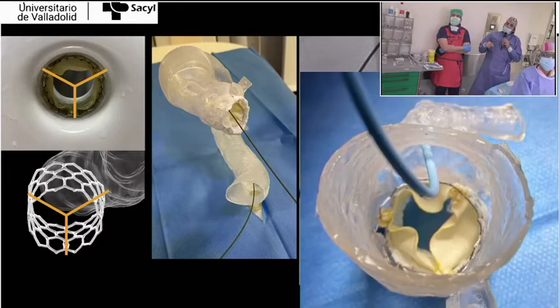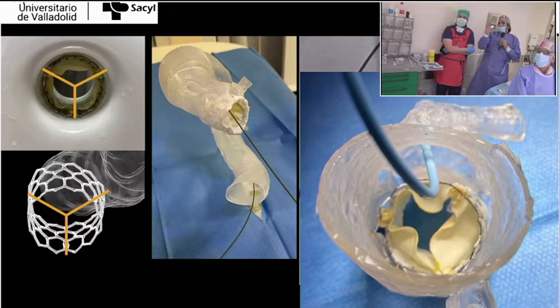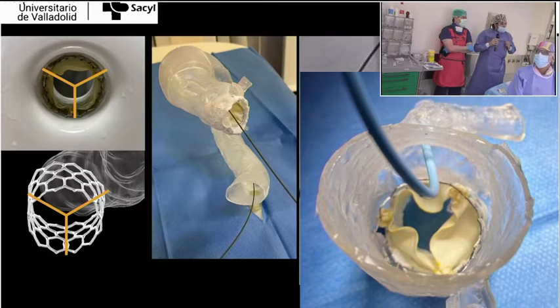with the patient. And here it is more easily seen. We engage the left coronary artery with a catheter, and we can see that the commissures are at about 60 degrees from there. So this means that it's a good alignment of the valve. And now my colleague, the fellow Raúl Delgado, is going to introduce today's case.